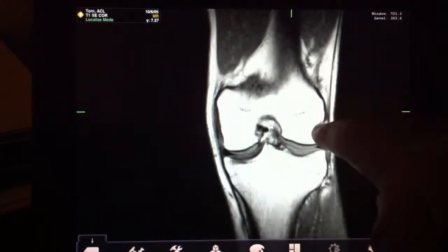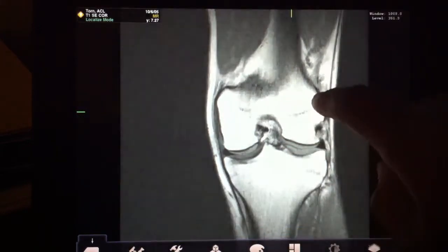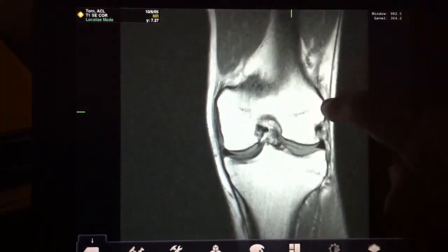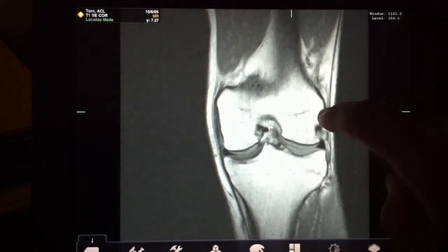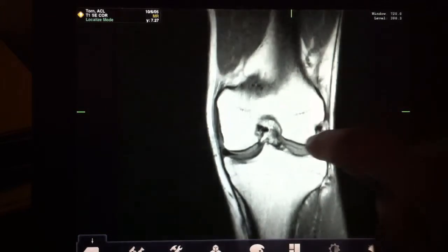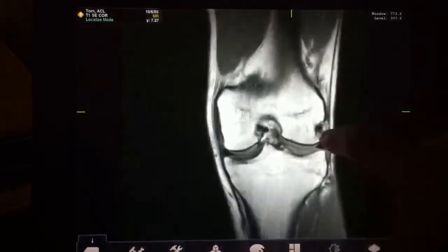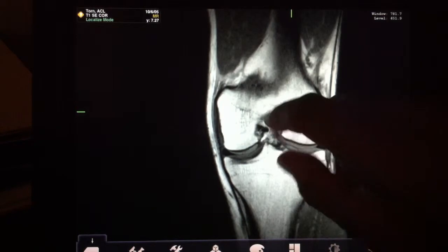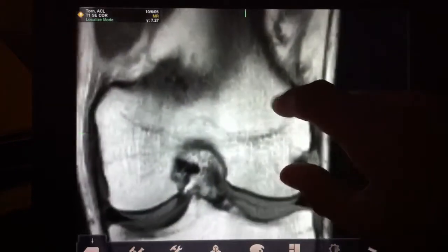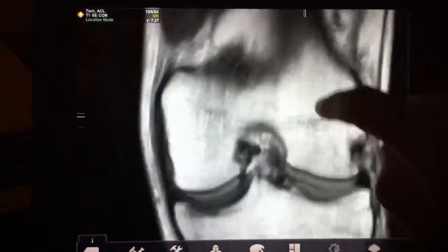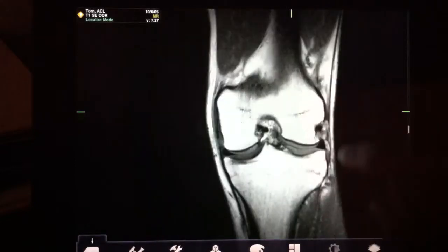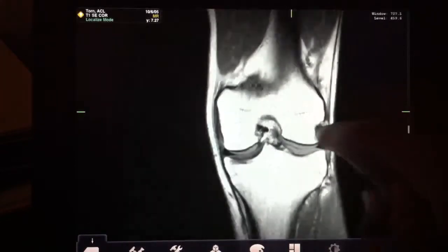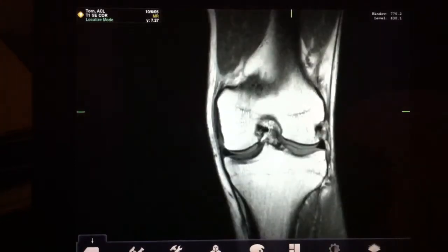The windowing is simply changed by dragging your finger up and down. You can see the numbers, although they're kind of small, in the top right-hand corner for the window level. Like most other iOS apps, you can pinch and zoom, and once you're zoomed in, dragging becomes a panning motion. If you zoom back out, dragging again goes back to window and level.